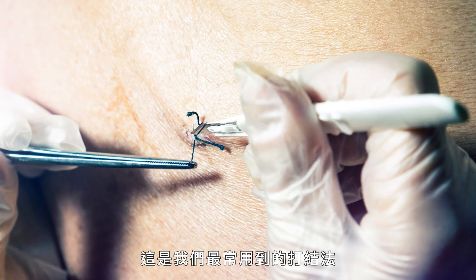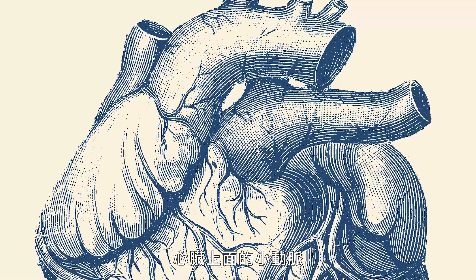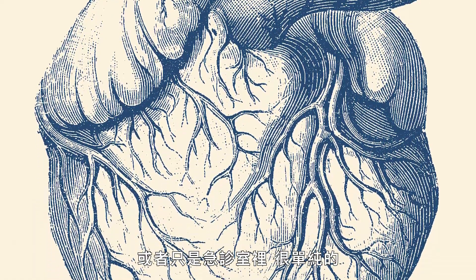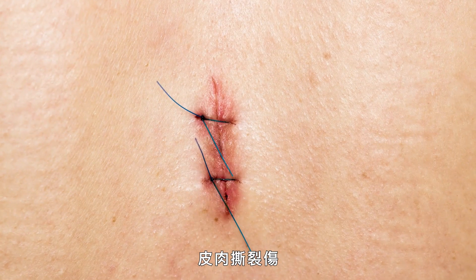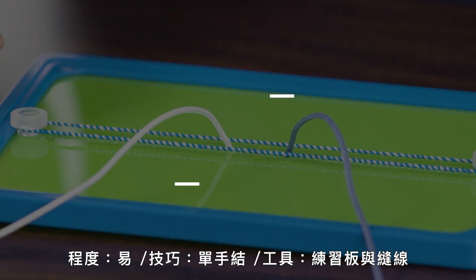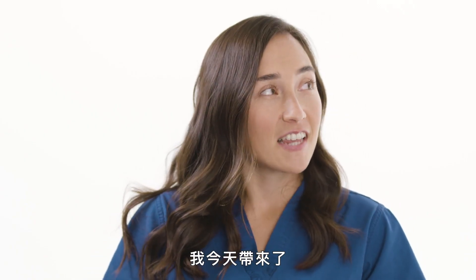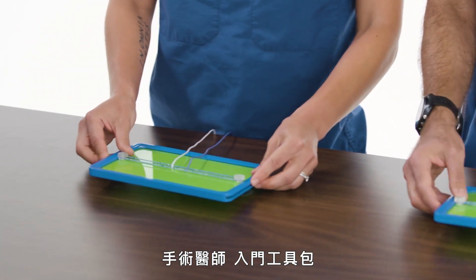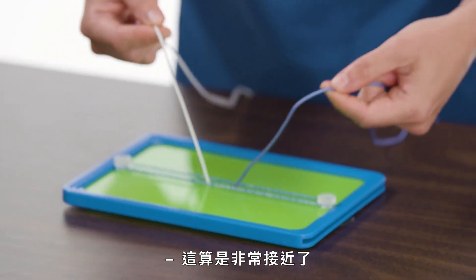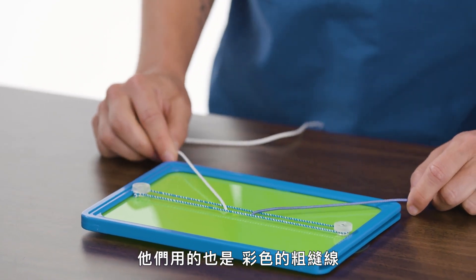This is a knot we tie everywhere — whether we're fixing the inferior vena cava during a major trauma case, sewing little arteries on the heart, or closing skin of a little laceration in the emergency room. It's all the same knot. To help you learn knot tying, I brought you the surgery resin starter pack. Is this an official training tool? This is pretty darn official. When students are first learning how to tie knots, they use multicolored large-bore yarn, just like this.